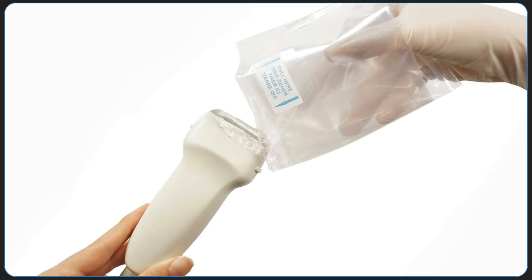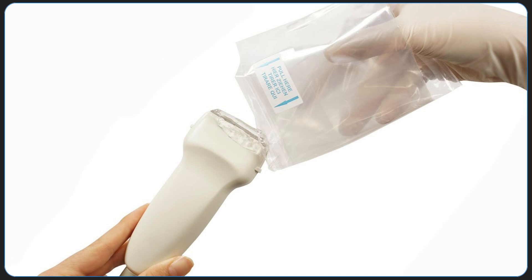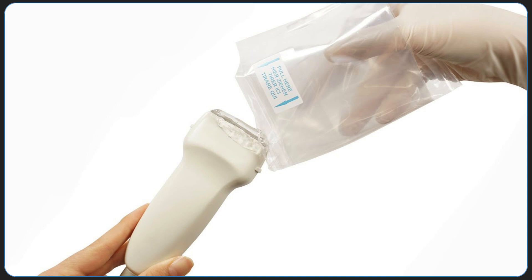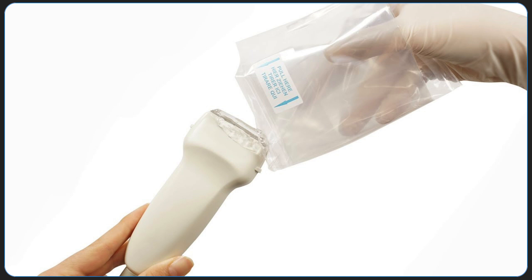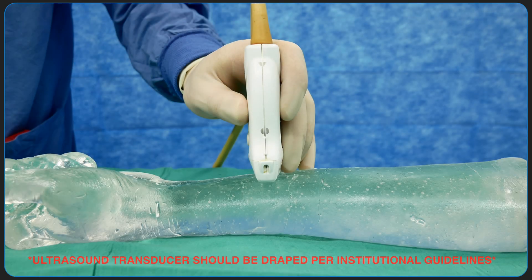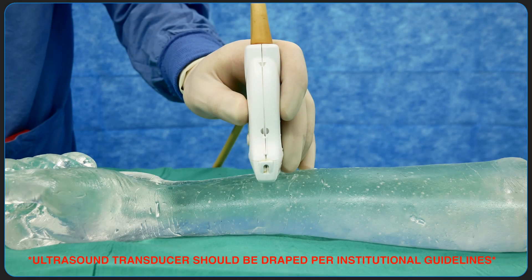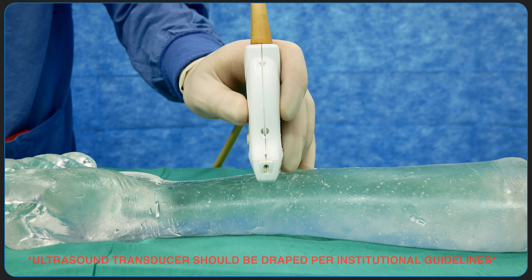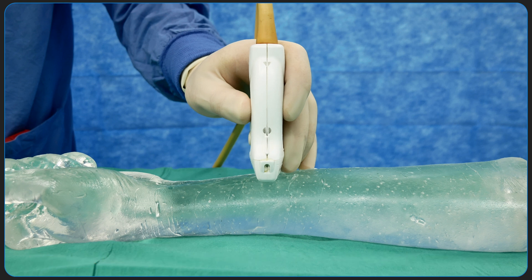As a reminder, ultrasound transducers should be draped according to institutional guidelines. The steps will now be repeated again on a simulated arm to reiterate the relationship between the ultrasound transducer and the angiocath.